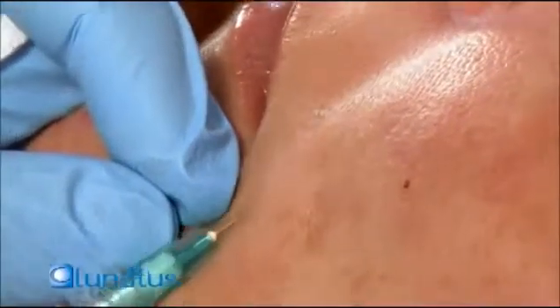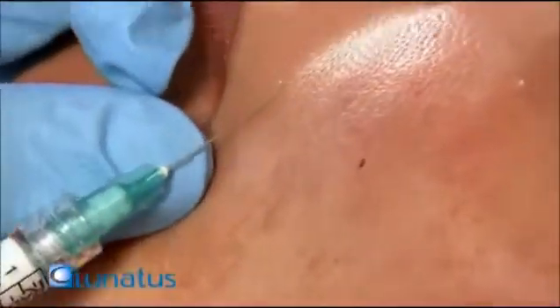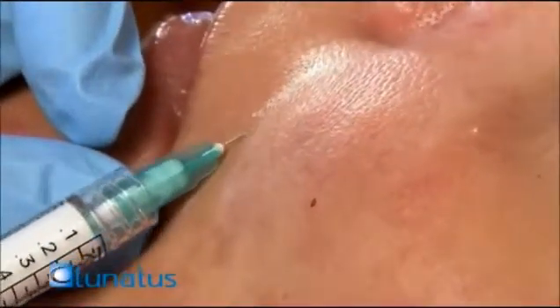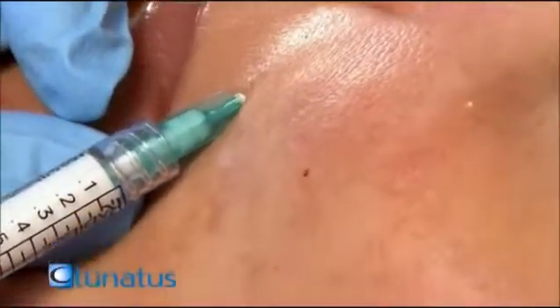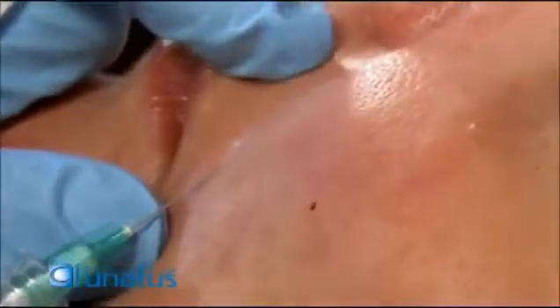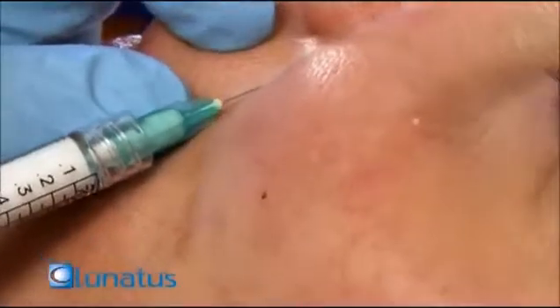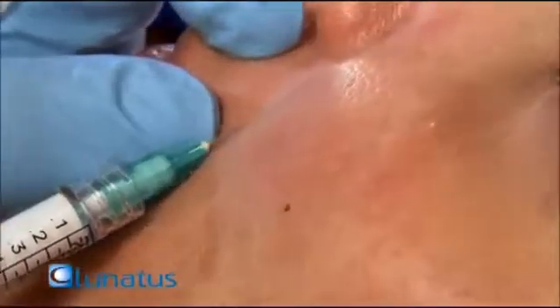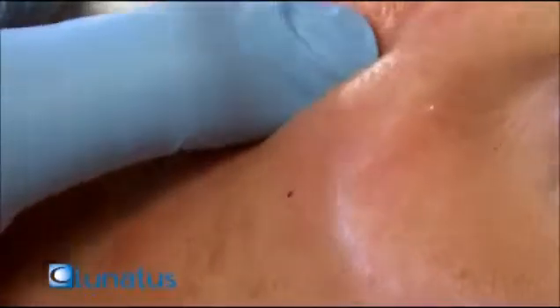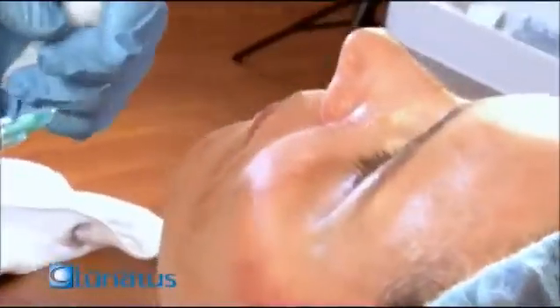Now moving to the other side — going in, a little bit coming out, then we stop and move a little bit up. That area should be anesthetized just a little. Then finally we do the marionettes. For the marionettes you basically look at the angle, follow the angle — that's where it is. The insertion is right here. Inject a very small amount.